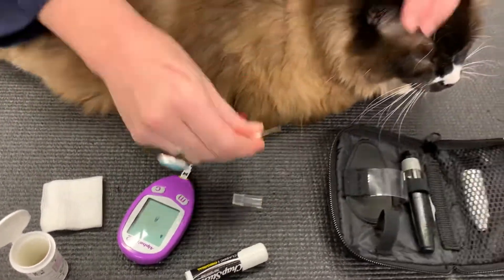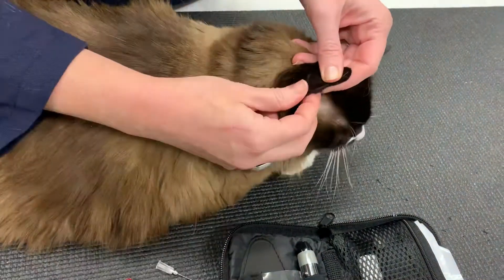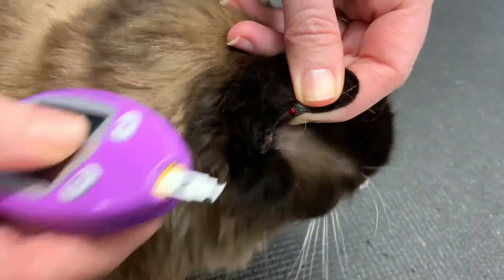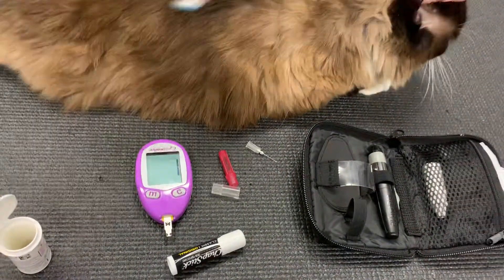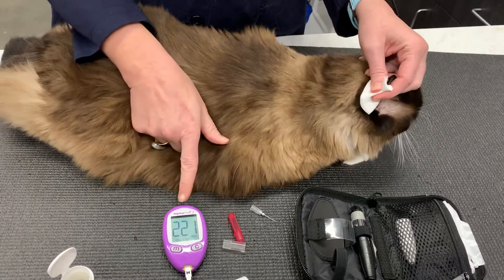I go ahead and hold the ear carefully. I poke the vein just once, like that, and I squeeze on either side. You can see the bead of blood come up. I touch it to the black part of the test strip, I hear the tone, and our blood glucose is 221.